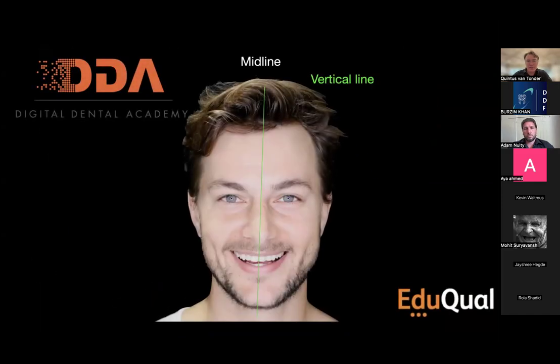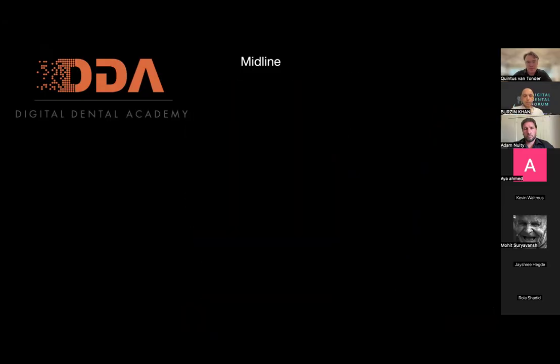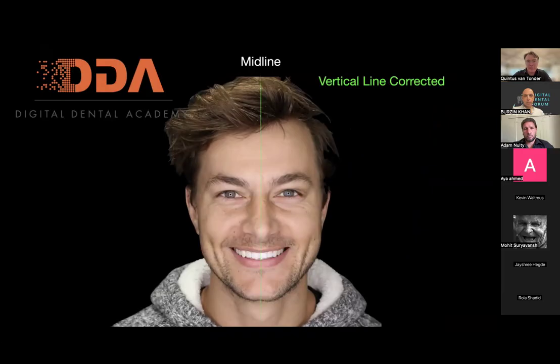So if you look at this, it shows the vertical line of the patient and the midline. And the midline, if we make it in the midline of the face, that's great. The vertical line is slightly canted, and that is what we've analyzed from looking at the photo. Next slide, please. And then when we've corrected it, we can see the vertical line and the midline are now parallel to each other.